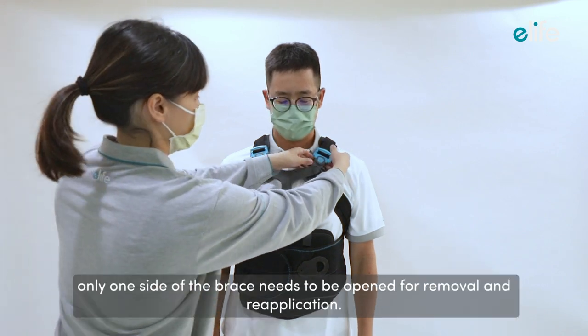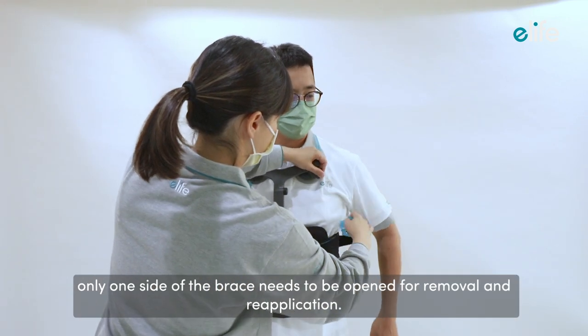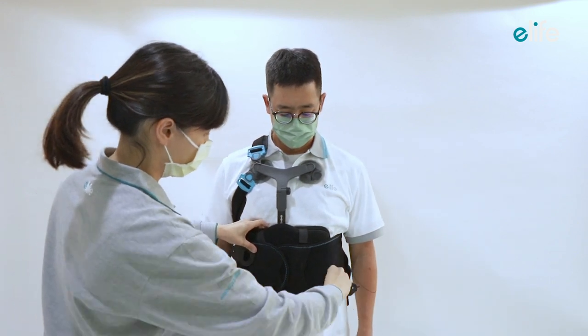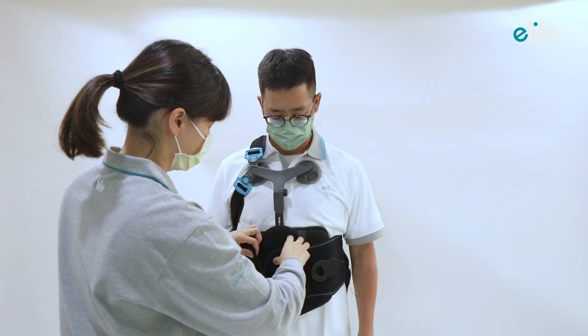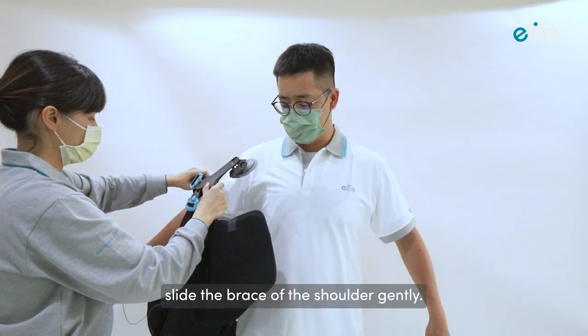For removal of the brace, only one side needs to be opened for removal and reapplication. Detach one side of the straps, release both compression pull tabs, and detach one side of the brace wing. Then slide the brace off the shoulder gently.